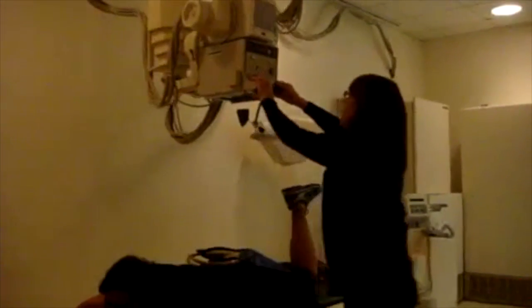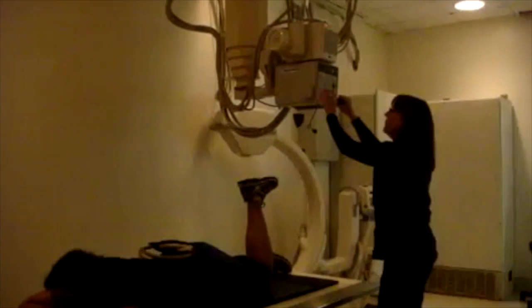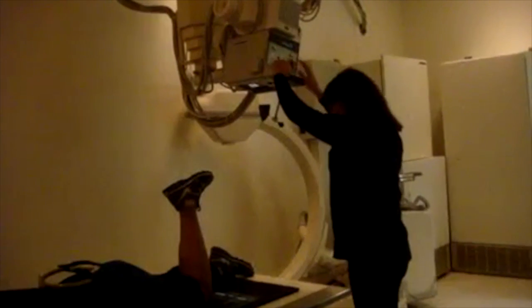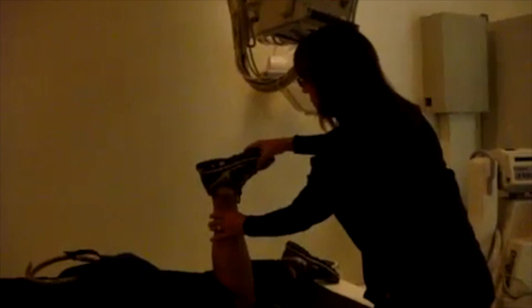This time my tube angle will be 5 to 15 degrees cephalad, and I will be entering the patellofemoral joint space. And now I move my patient. So the central ray is entering the patellofemoral joint space. And what I need to do, if the patient can't hold the leg, I might have to immobilize the foot with tape. But it looks like she's able to do it.